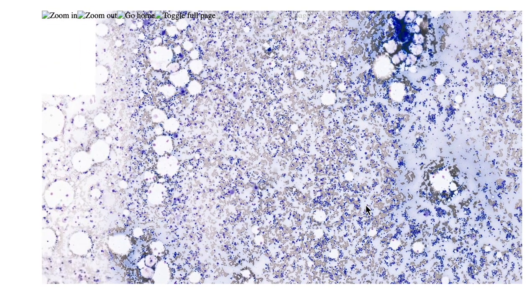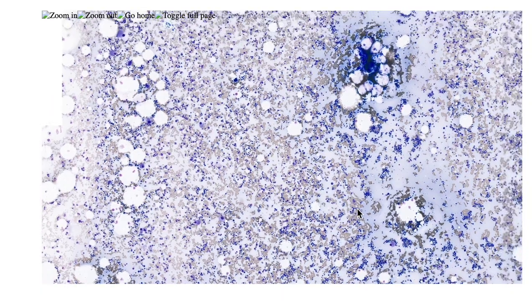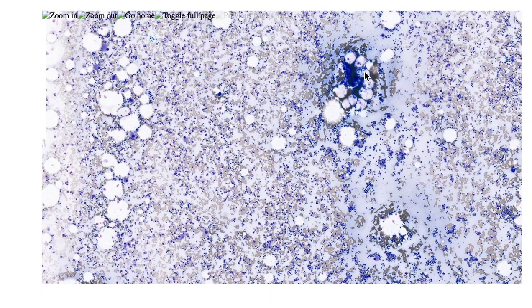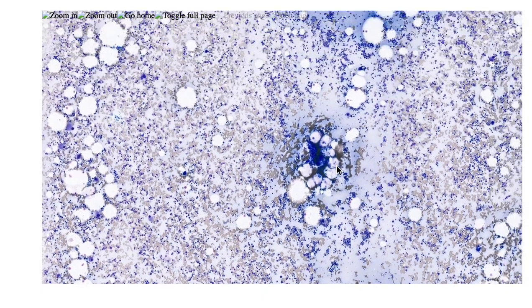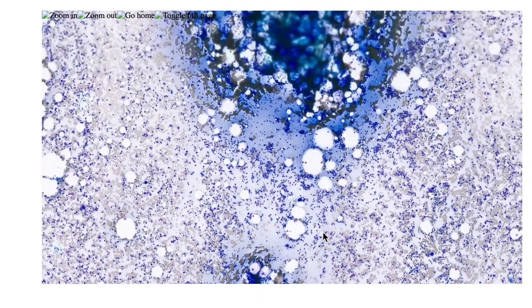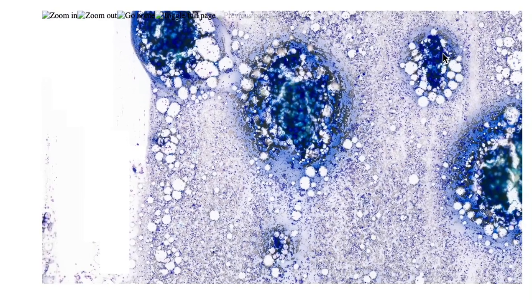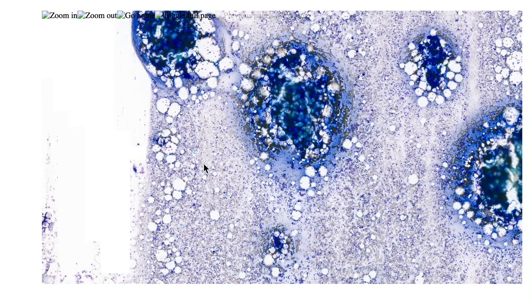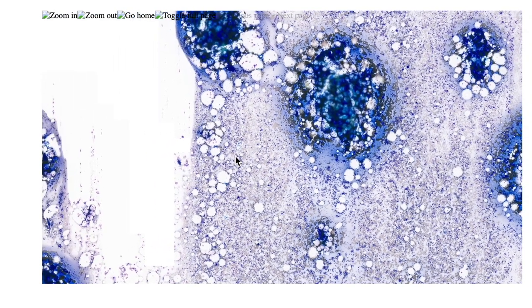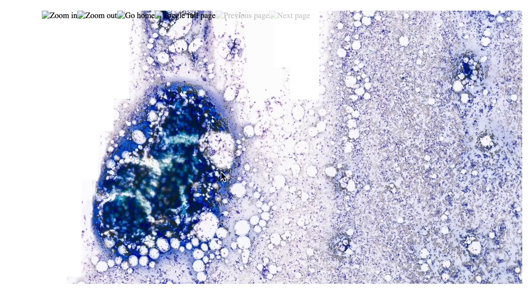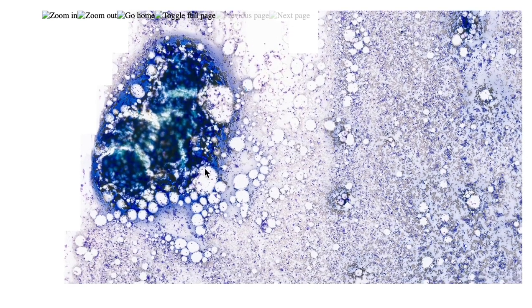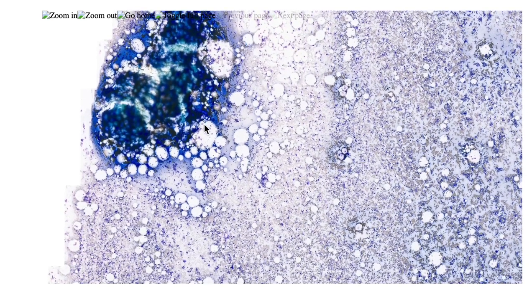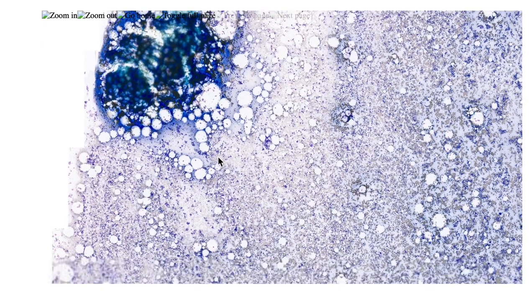So you can see there's a bone marrow aspirate. You can see the particles here — there's one more big particle here, a particle here, and a particle here. I'm not going to comment on the cellularity here because I do have a bone marrow biopsy as well. Biopsy is a better way to comment on the cellularity than the aspirate.